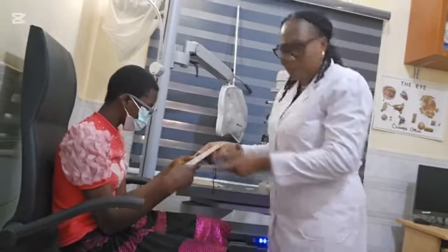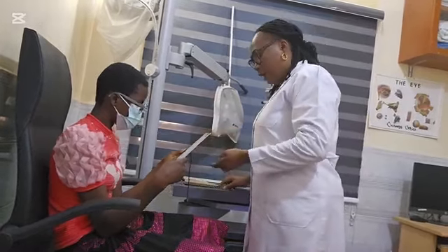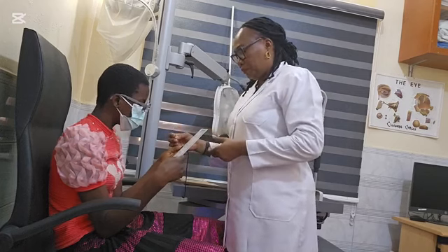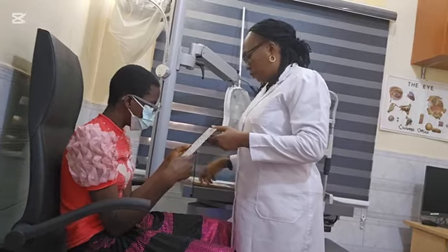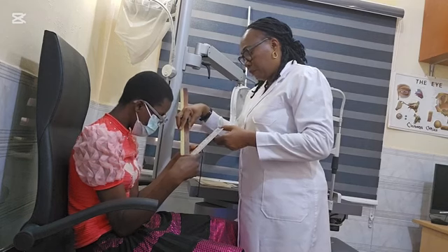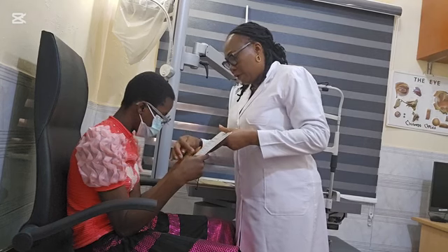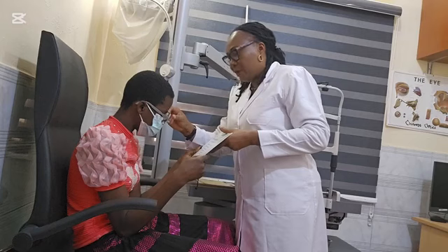Okay, we are going to do that at 25 cm. Okay, that's fine. We'll also do that monocularly. So go ahead and read. Let's go down. The Lord put the gifts in a long green box. Okay, come here. And when. Okay, lovely. So that's what you can read. So at near, for the right eye, she could read 1.6 M at 25 cm.